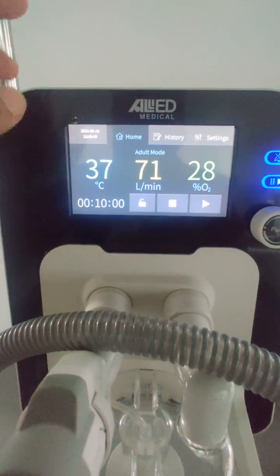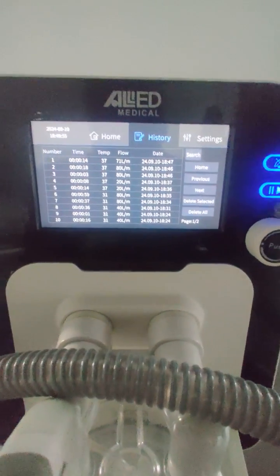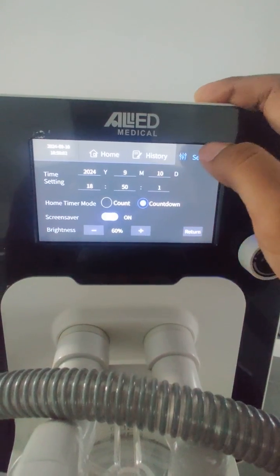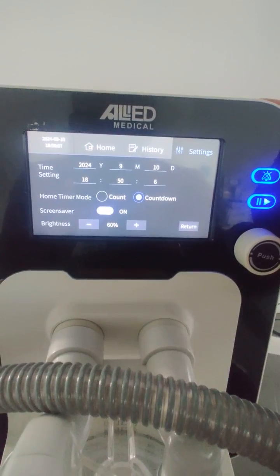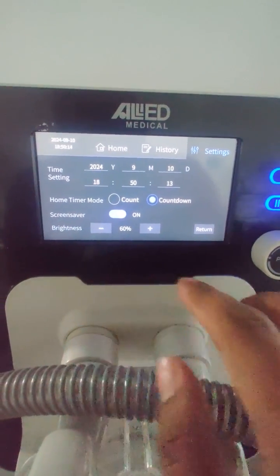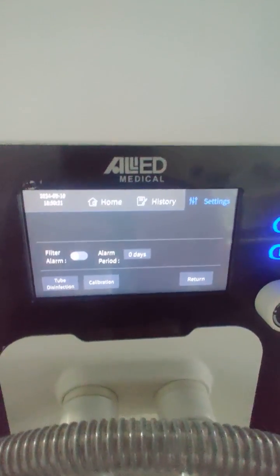The machine stores logs and alarm history, viewable in the history option at the top. In the settings menu there are several options: general settings allow you to set the date and time, configure the timer mode, and adjust the screen brightness.